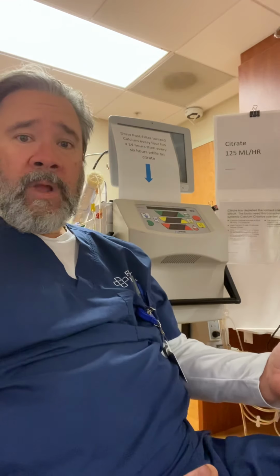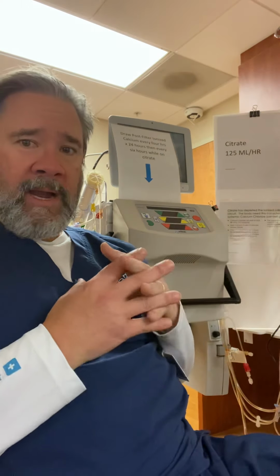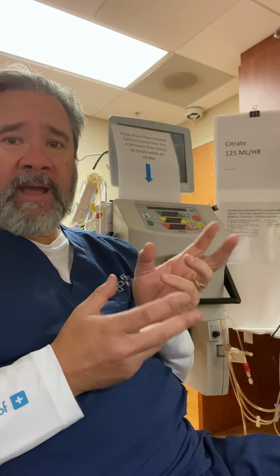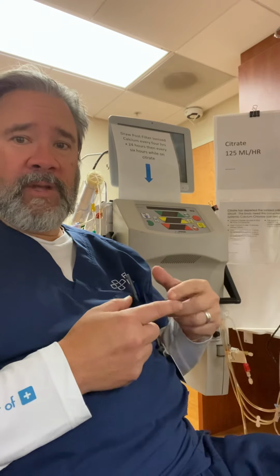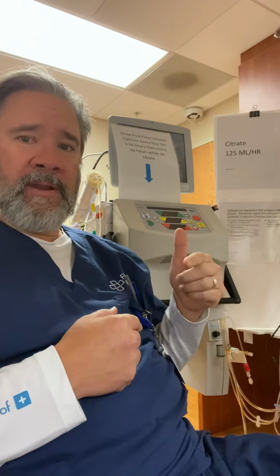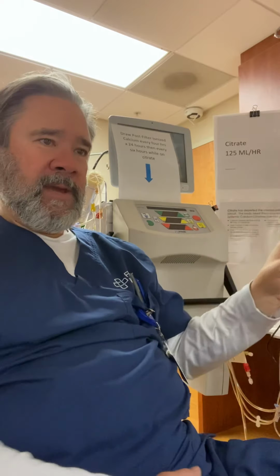So citrate is given to bind with free calcium. So the free calcium is part of the clotting cascade, and if you don't have free calcium, you can't make a clot. So what we do is we give it into the circuit to mix with the blood, preventing clots in the filter. And then on the other end, we replace the patient's calcium because we depleted so much in the circuit. So anyways, back to the beginning.